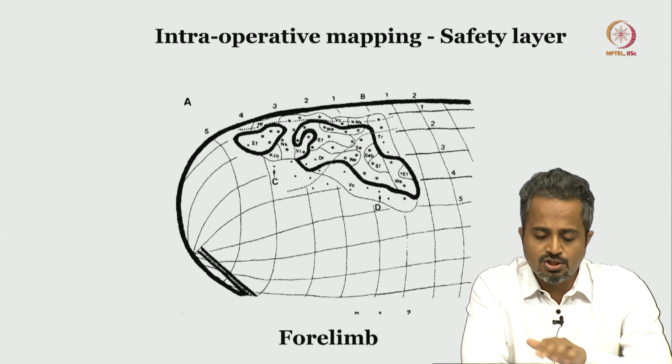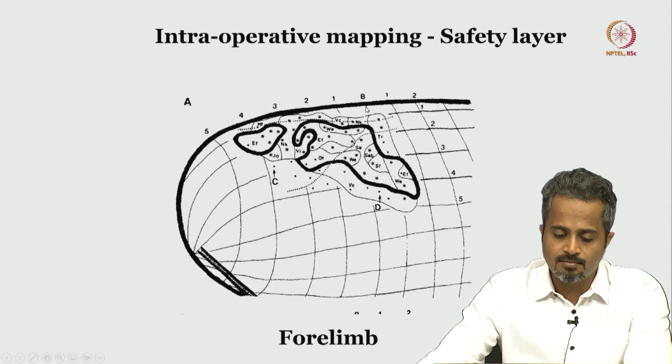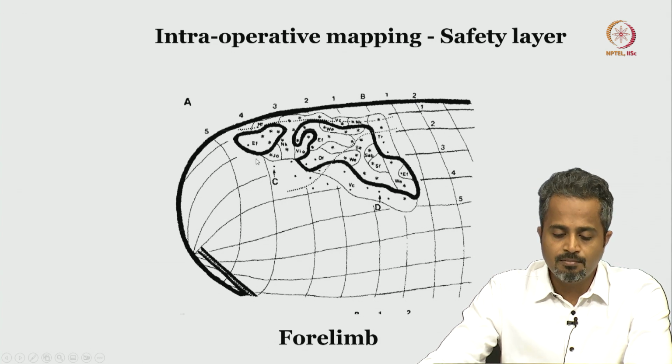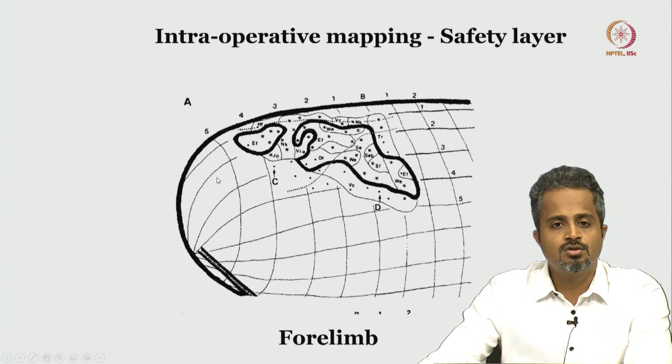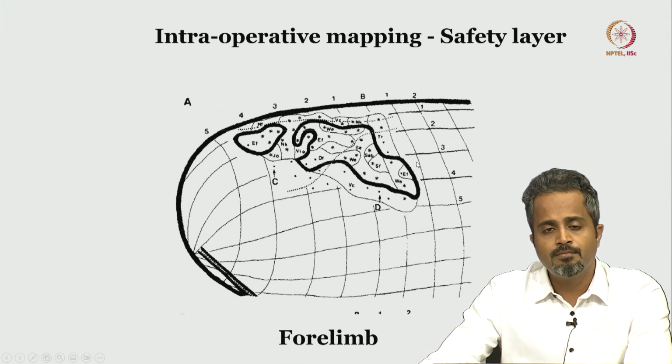For example, what has been shown here is the rostral forelimb area, and that is the caudal forelimb area, and these are the coordinates. B is for bregma and so many millimeters posterior, lateral and anterior to bregma. This is the left hemisphere of the rodent motor cortex, which has been divided using 1 millimeter cubical areas based on the coordinates. Okay.